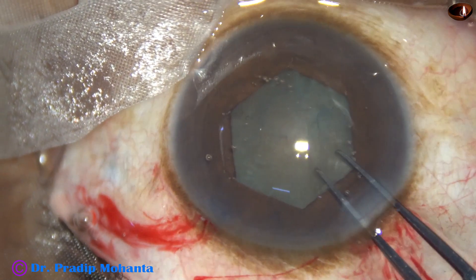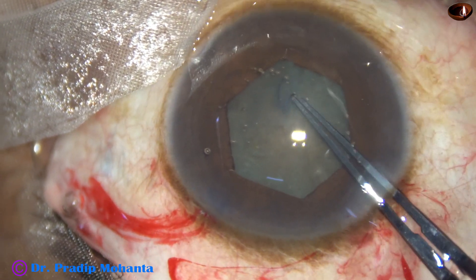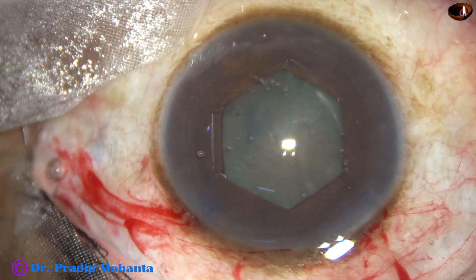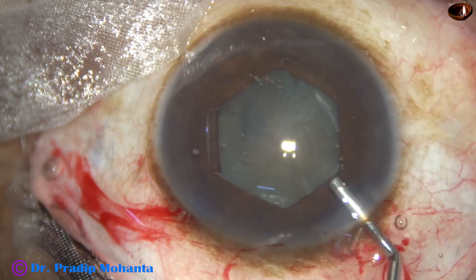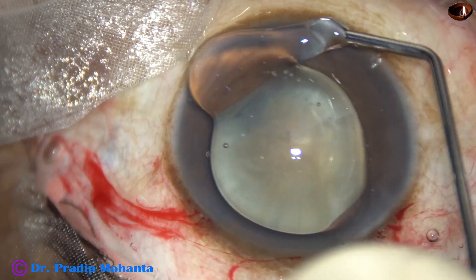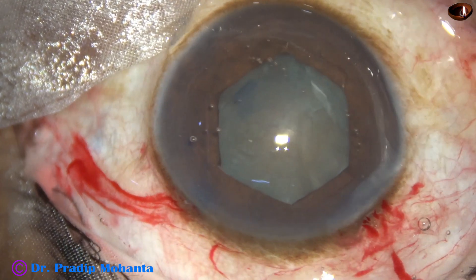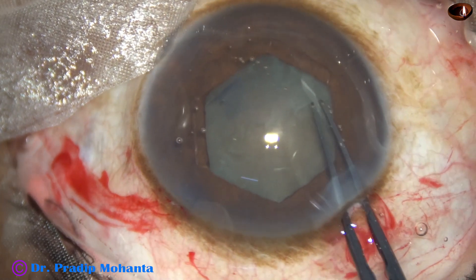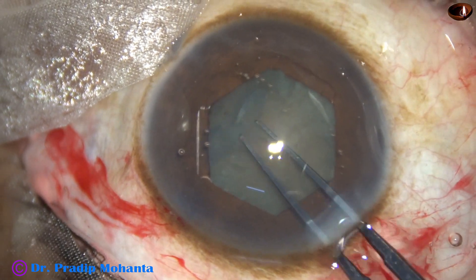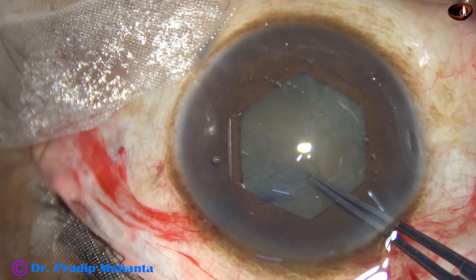The size of the rhexis is going to be about 5 millimeters. The staining was not very good in this case, and visibility is not great. To improve visibility, I apply some visco over the corneal epithelium, and now I can see a bit better. I use the utrata again to complete the capsulorhexis — the continuous curvilinear capsulorhexis is now completed.